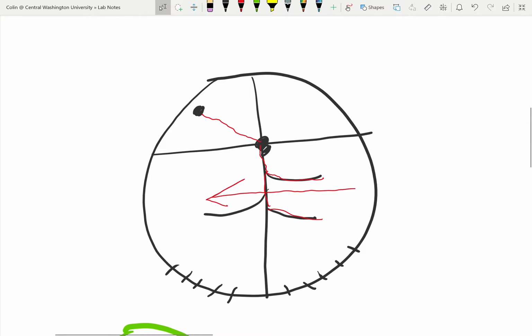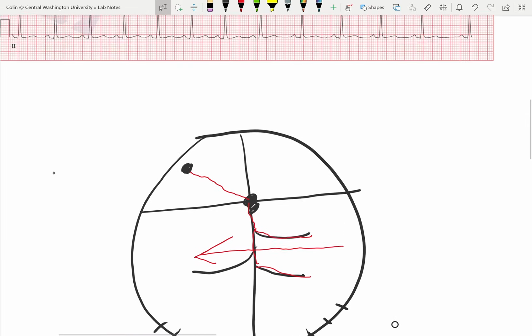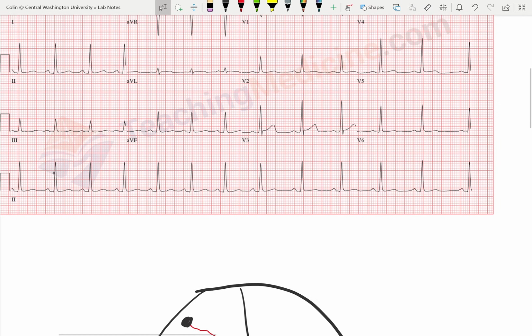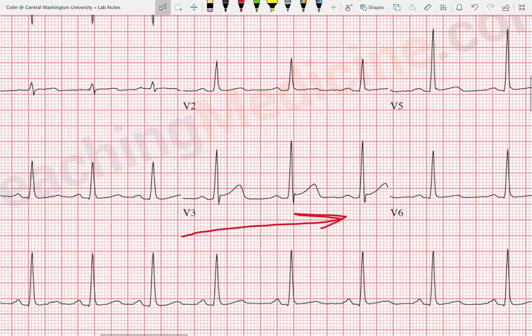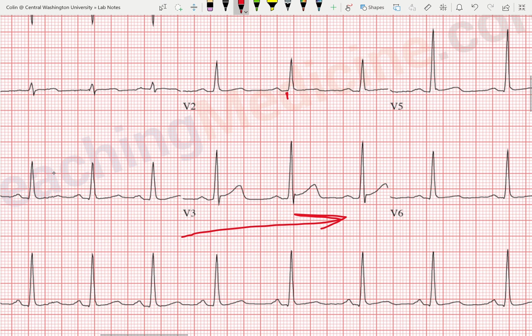And so what that does on our 12 lead, if we remember when we were talking about the 12 lead, when we go from left to right, we're talking about time. Okay, so if we zoom in really close here to one of these QRS complexes, and we count the time from here to here, okay, we notice that that's about 2 boxes, or we're going to say 0.08 in time.